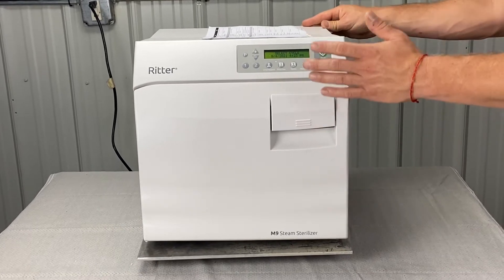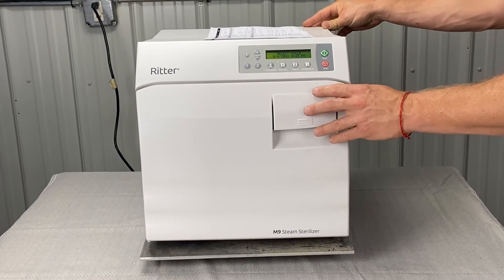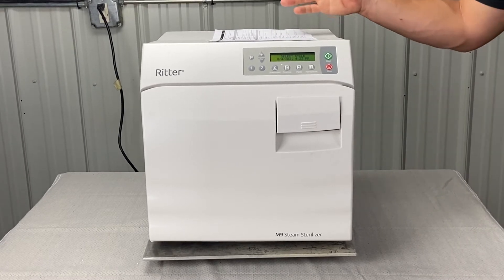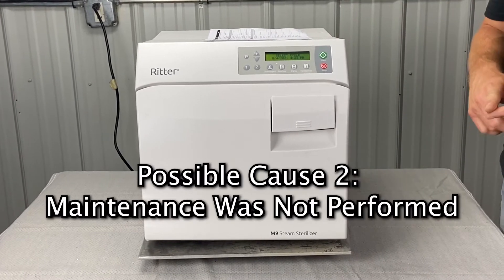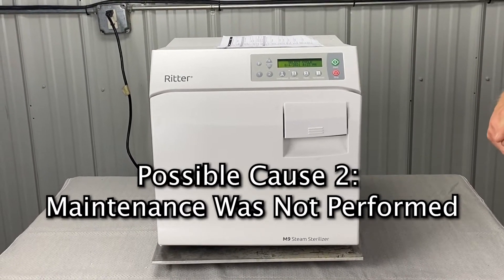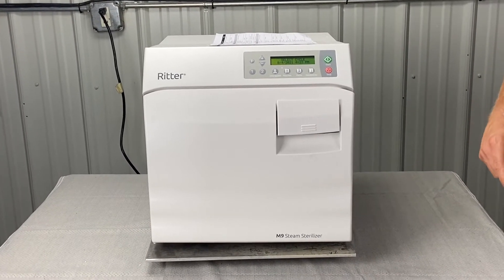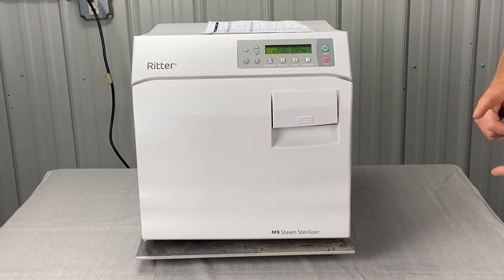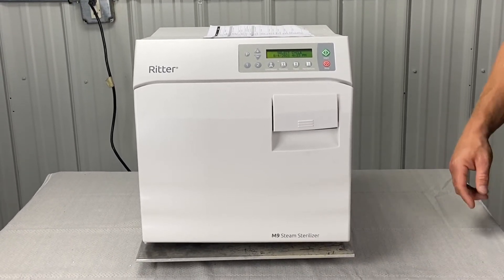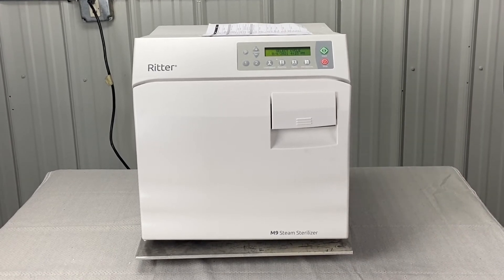If you fail with 983 on the second cycle after it's empty, that's where we'll have to pay attention and dig in a little bit deeper. If you haven't done your maintenance in a while, verify that or refer to the video for your weekly and monthly maintenance. That's going to cover the filter, cleaning the reservoir, making sure nothing's in the chamber, and so forth.